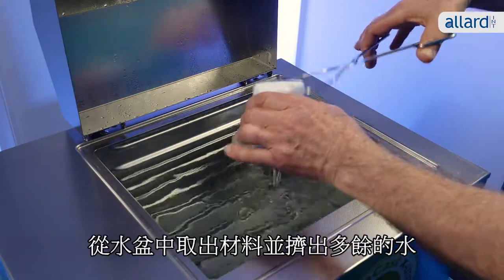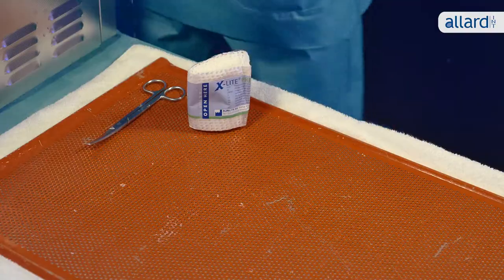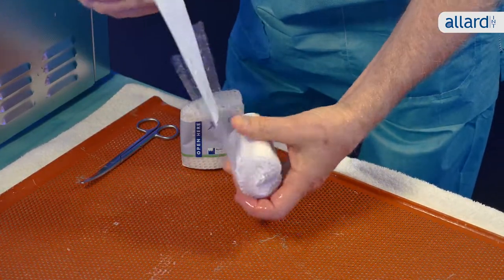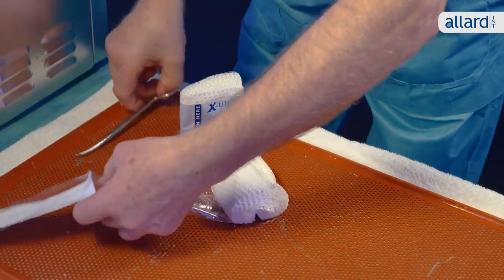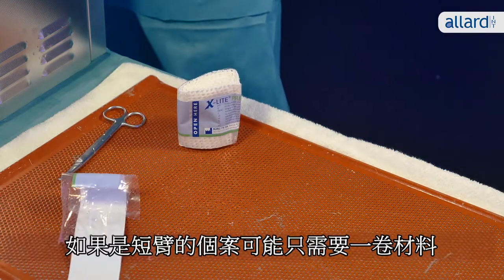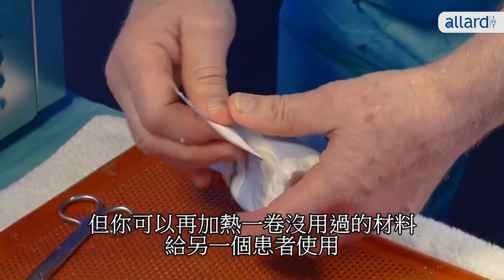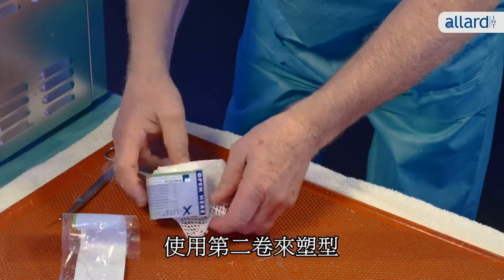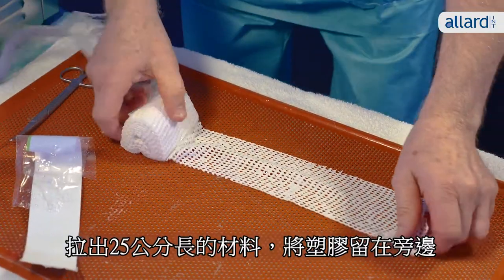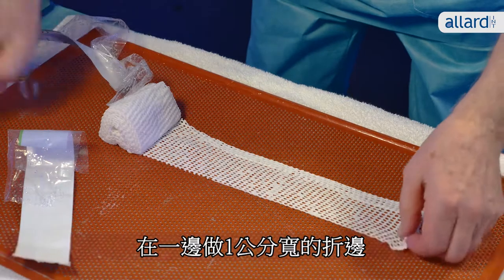Remove the rolls from the water bath and squeeze out the water. Prepare the first roll by removing the label and put it back in the water bath. For a short arm, you might only need one roll, but you can always reheat an unused roll for another patient. Use the second roll to make a nice smooth start on your cast. Roll out 25 cm of material and leave the plastic on the side.